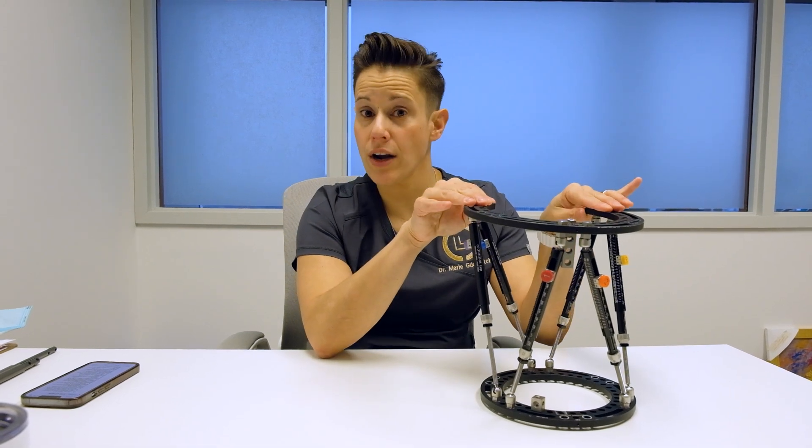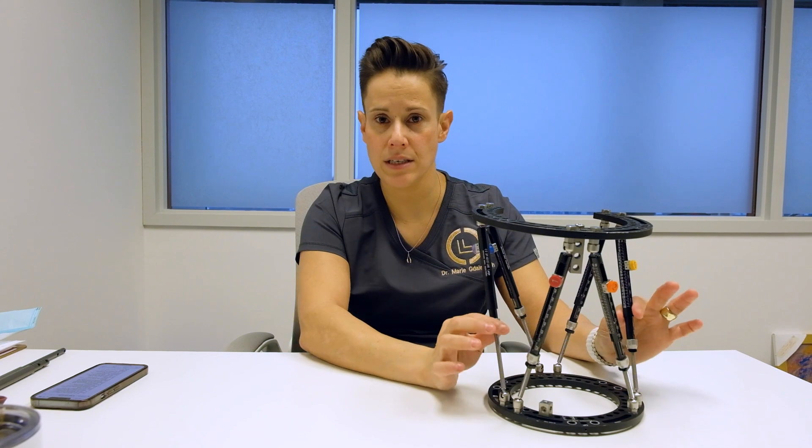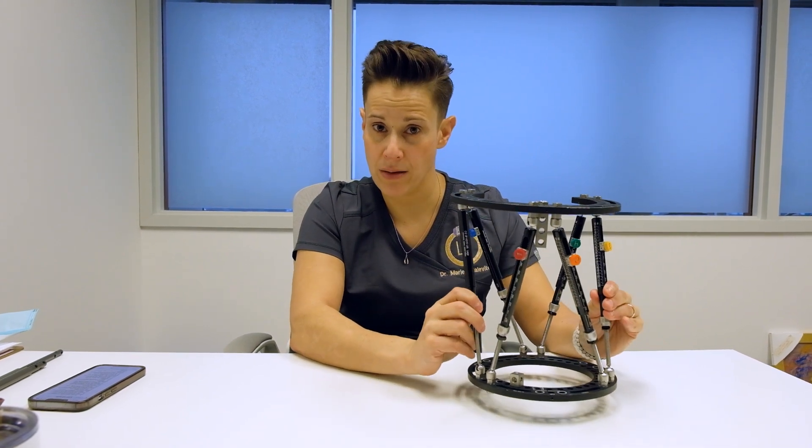We use this for cases where patients cannot have an internal lengthening device like the nail, and so sometimes in younger children with growth plates, or patients who have a deformity and a limb length discrepancy will need the external fixator to be able to lengthen.